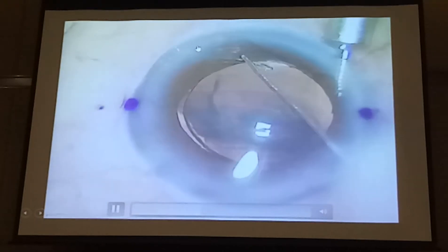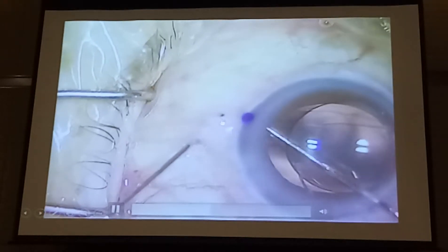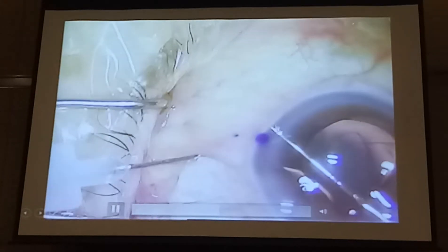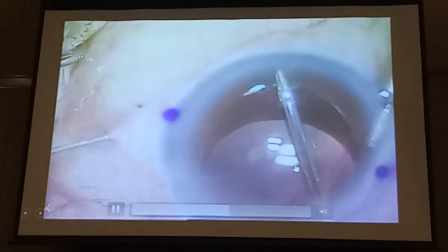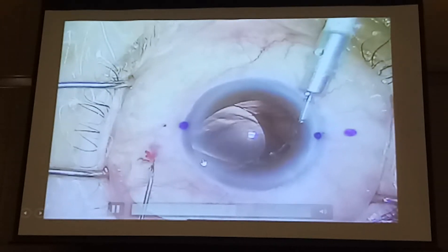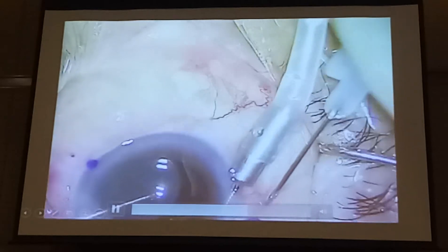So you put this now in the anterior chamber, and you want to put it in this position — 90 degrees to your final fixation point. So you go in there, and when you think you've reached this point, you turn 90 degrees down. But you don't really know where it has entered. Thread it in. So this first haptic — it's always easy. Now you can pull it up; you may be scared, you have no assistance, you might drop it. Do this fixation point first, and then you can do the other.